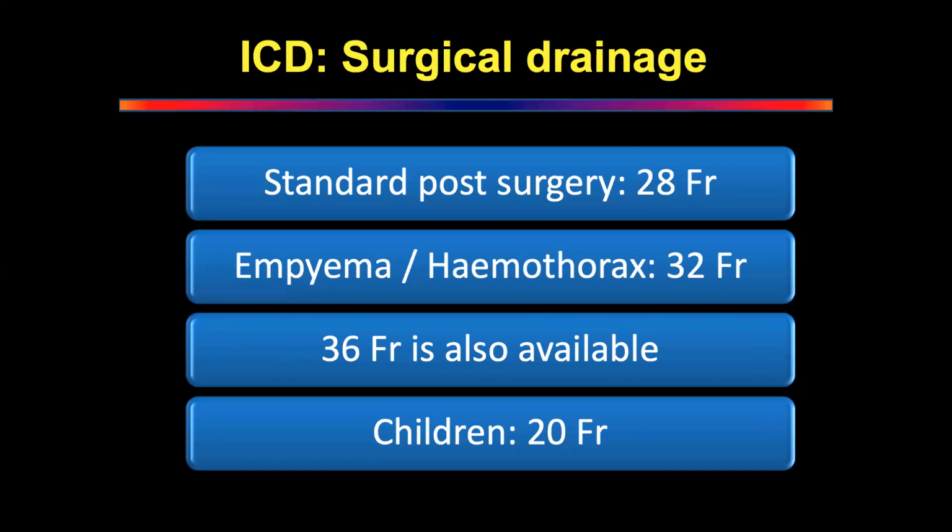A bigger one, there's 20, 24, 28, and 32. These are the numbers you have to remember. And there is no right, no wrong. There is no guideline which actually talks about one being better than the other. Okay? It's absolutely all right.